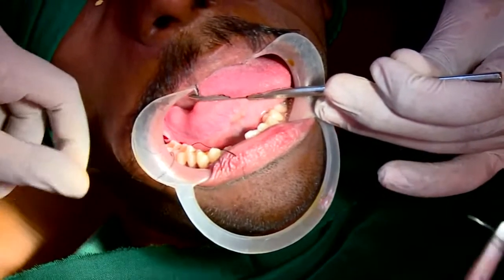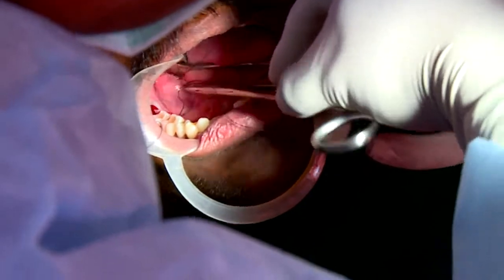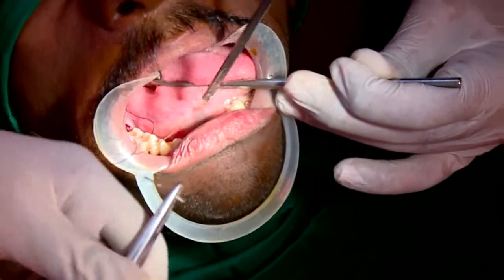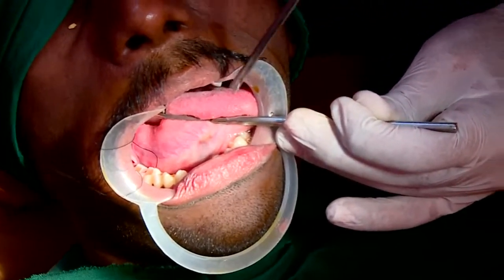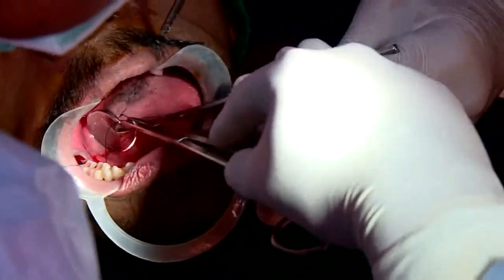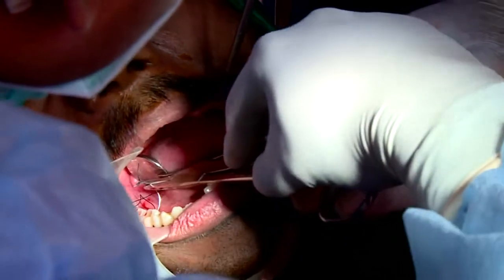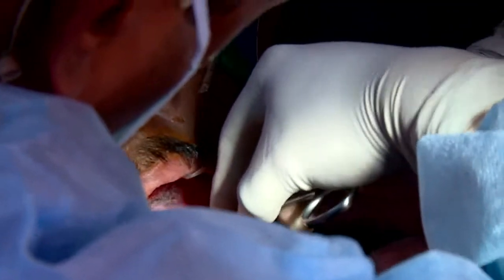So you have been able to visualize an ideal tooth, a horizontal, typical impaction to do, and all the difficulty that you may encounter while doing a horizontal tooth. If you plan and have an idea how you are going to go about it, then it is quite easy to do. It just needs a little practice and application.